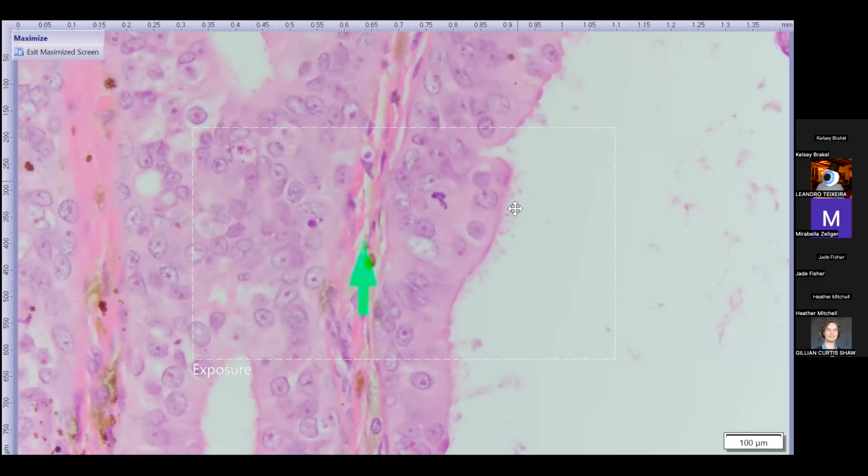Got these sort of little fingers coming off the apical end of these neoplastic cells. So that is a ciliated apical border. Probably the most common metastatic carcinomas to the eye of cats are respiratory carcinomas, especially pulmonary, but maybe also nasal is possible. And with this pseudostratified columnar appearance in some areas of these epithelial cells and the ciliated border, that adds an additional level of suspicion that they should probably go check the lungs on this kitty.